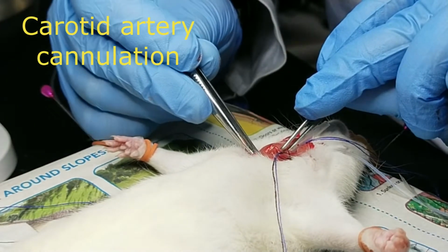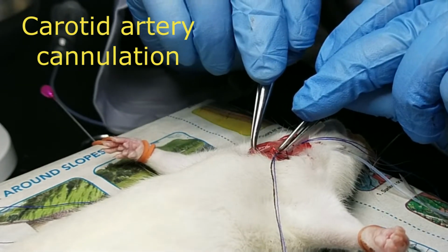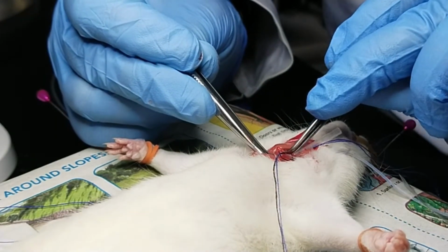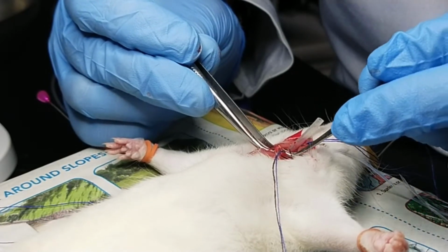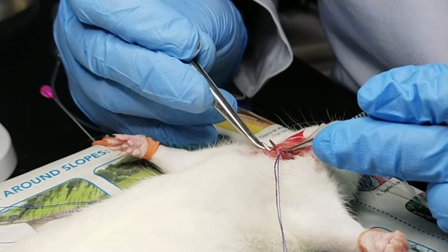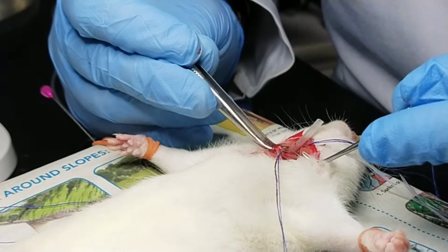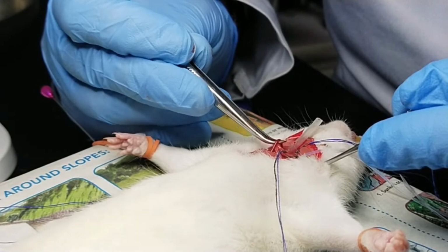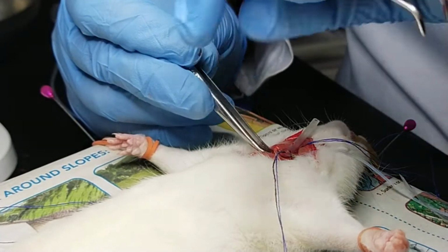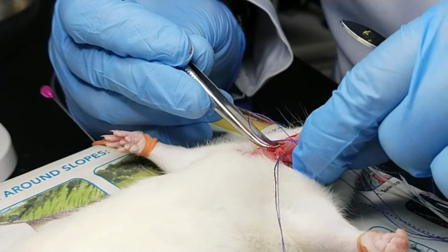Next is the artery. We are going to locate the artery. The artery is actually quite at the back of the trachea, and usually it is in line with the vagus nerve. So we have to isolate the nerve first to get to the artery. The artery is a bit stretchable. Once isolated, we are going to put this thread underneath the artery.